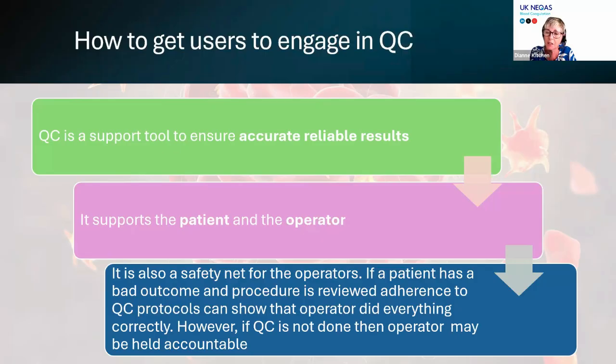Another question we got asked earlier in the webinar was, how do we engage the end user with QC? I like to tell the end users that although QC is a support tool, and people think of it as supporting the patient, which obviously it does, it also supports the operators. If there is a problem, a bad outcome, and procedures are reviewed, if you haven't done the IQC, if you're not following the protocols, then it might be the operator themselves that's held accountable. So you need that safety net.